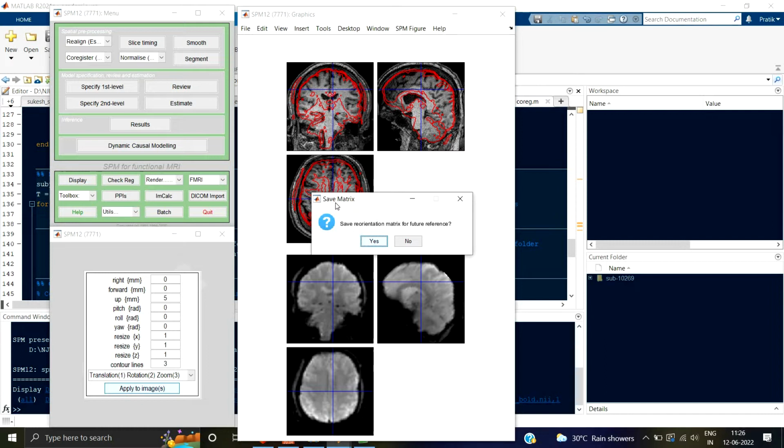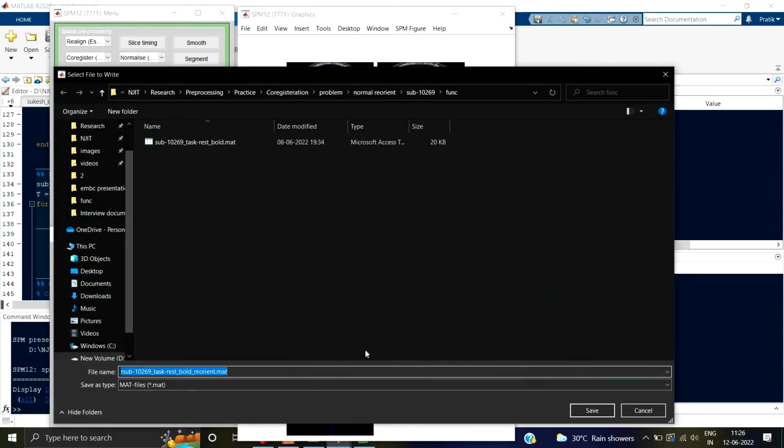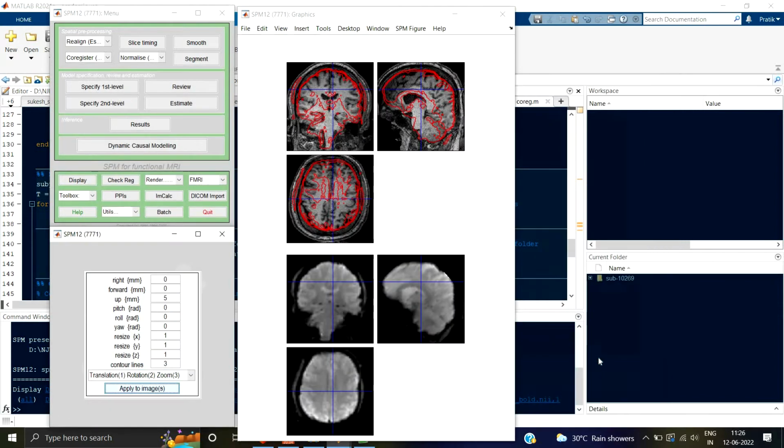Then it asks you whether you want to save the matrix. There's a matrix that will be generated for this transformation. If you want, you can save the matrix, or else you can press no. Maybe it is better to save the matrix. It's possible that in further analysis you may require it, or you may write somewhere that I reoriented this by this much up or whatever. So it is better to save it.